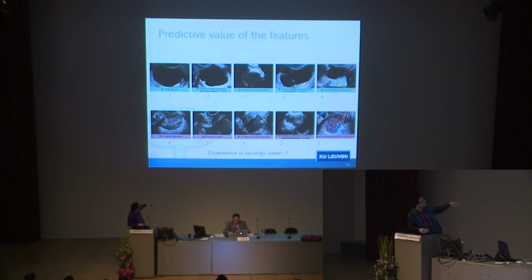You can see, for example, that the B1 feature, unilocular cyst, gets the lowest score. So this is most predictive of a benign tumor, which is probably not a surprise. And then the B3 feature, presence of acoustic shadows, has the worst score for the B features, -3. So that's the B feature that is, in relative terms, least predictive of a benign tumor.